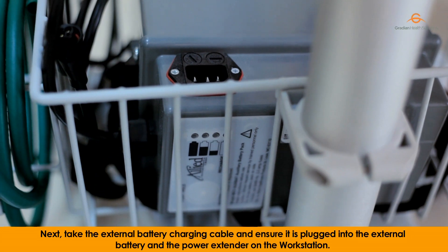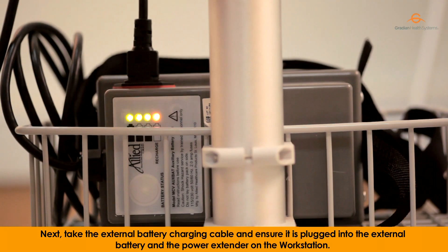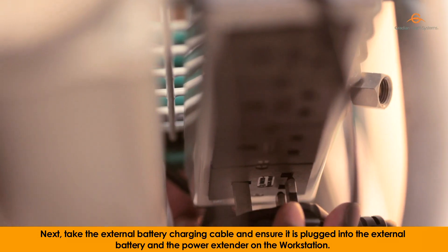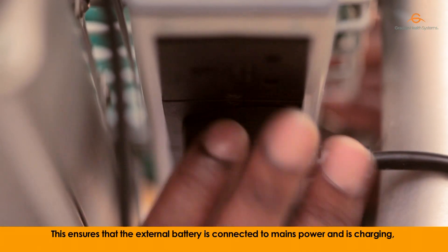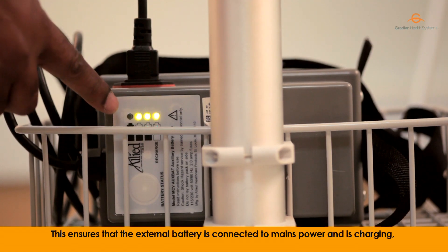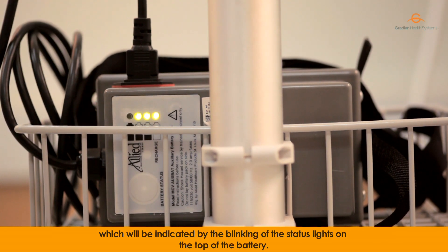Next, take the external battery charging cable and ensure it is plugged into the external battery and the power extender on the workstation. This ensures that the external battery is connected to mains power and is charging, which will be indicated by the blinking of the status light on the top of the battery.